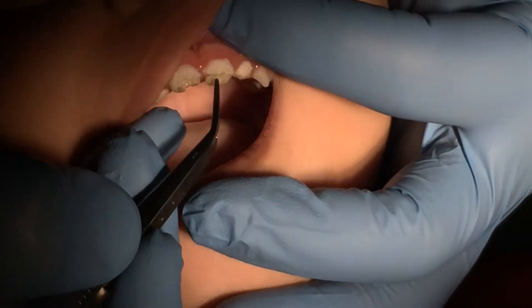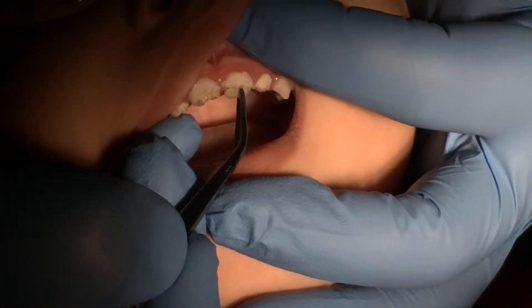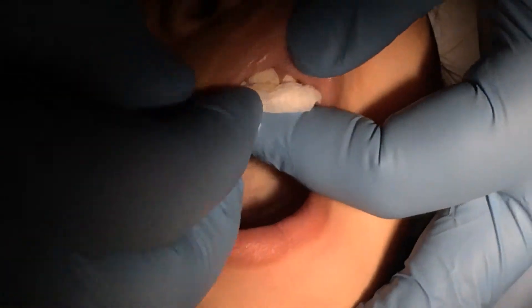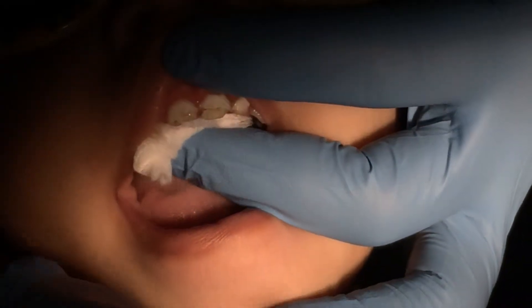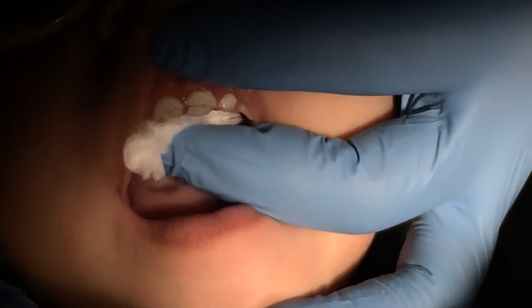So this piece actually is a moveable piece. What we're going to do is we're going to go ahead and put silver diamine on all of these guys. And so it's just one drop — that's all you need.